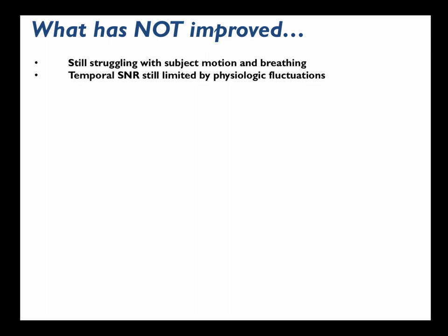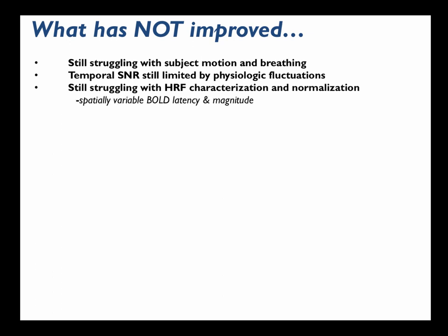Temporal signal to noise is still limited by physiologic fluctuations. We're still struggling with understanding the hemodynamic response function and how it varies over space and how it varies across populations. If we better understand that, we might be able to pull out more temporal information, more causality information, and so on.